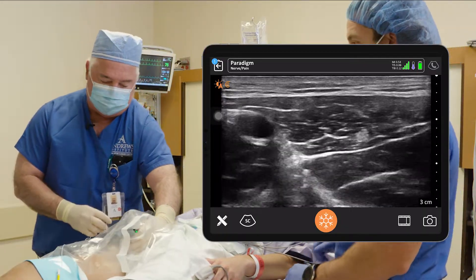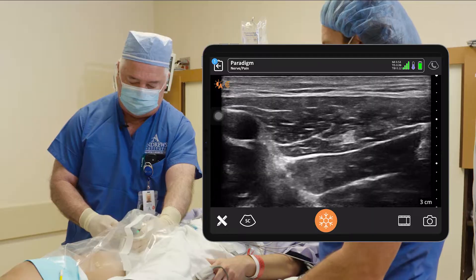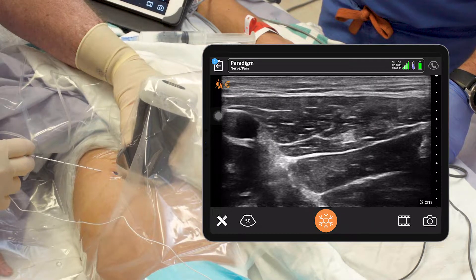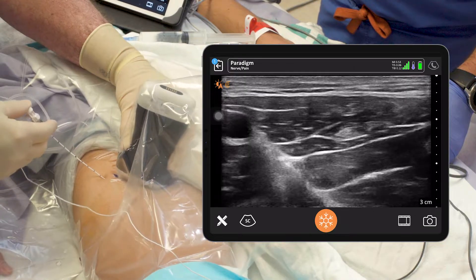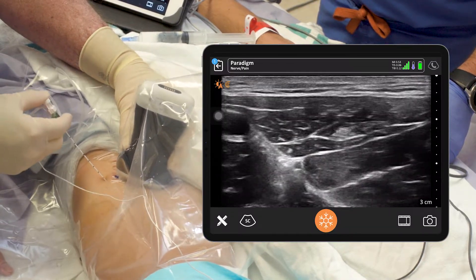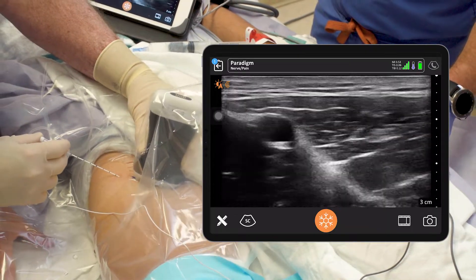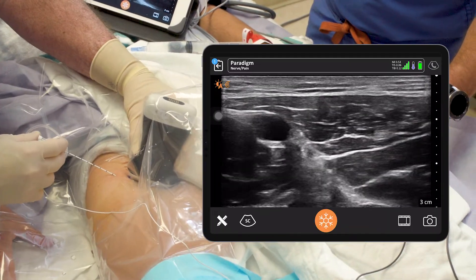So this is part three of our ACL blocks. We've done the genicular and the IPAC, and now we're going to put in our adductor canal catheter. I come a little more proximal than most people — I think it gets both nerves really well, the saphenous and the nerve to the vastus, because they're pretty close together up here.